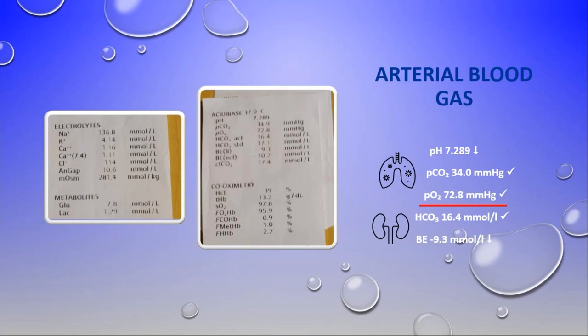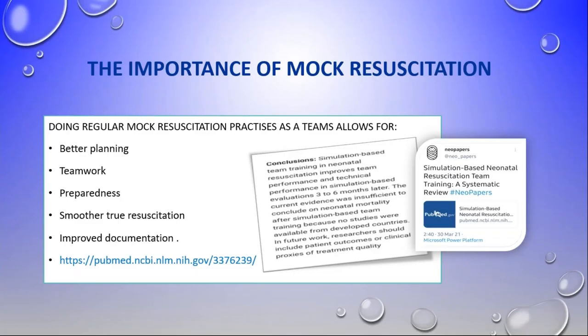If we were to make ventilatory changes, we wouldn't address the problem. Also, the glucose is rising here, so it's telling us this baby is stressed, and I can promise you this heart rate is sitting above normal. So that is how we would look at a blood gas generally.